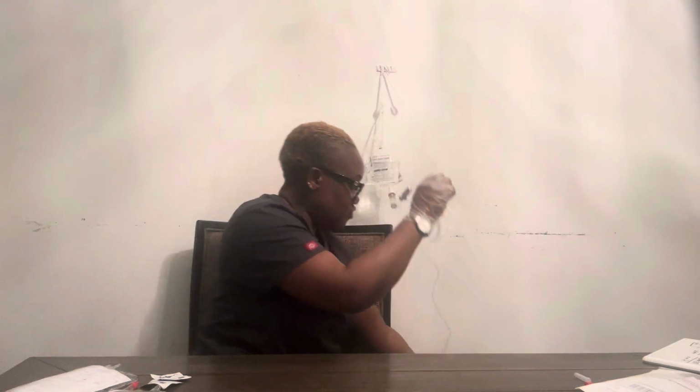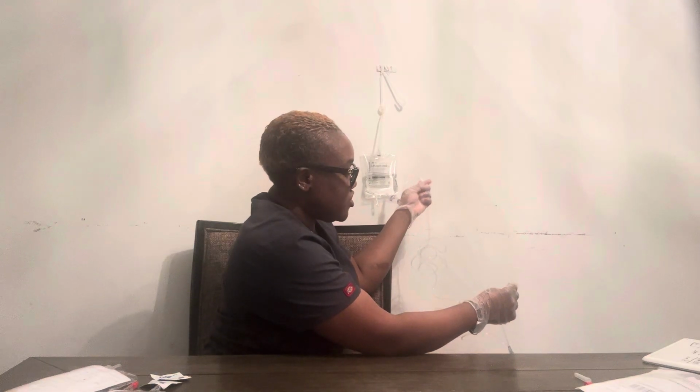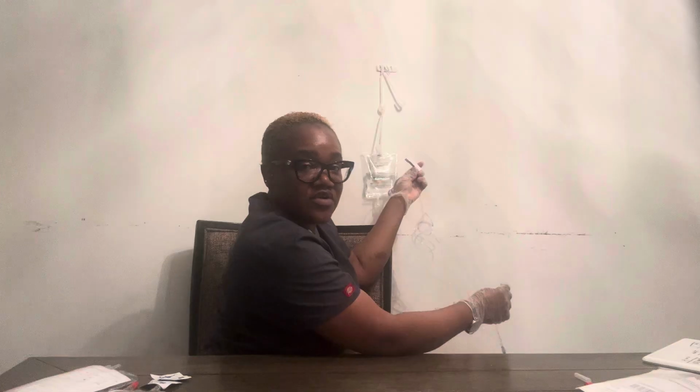I'm gonna allow the fluid to run all the way through my line, and it's dropping in my garbage can. Okay, so after I have allowed the fluid to run, I need to make sure that it runs all the way through, so there is no air bubble in the line. Then I'm gonna go ahead and turn off my roller clamp.